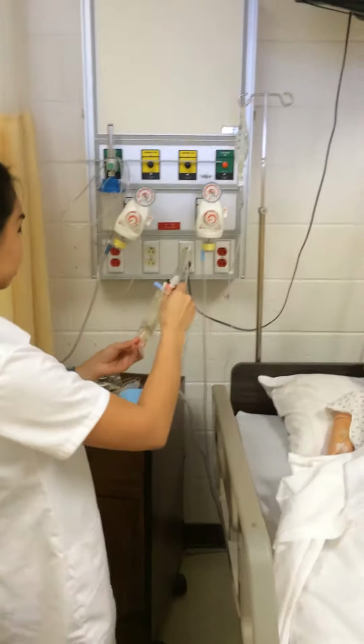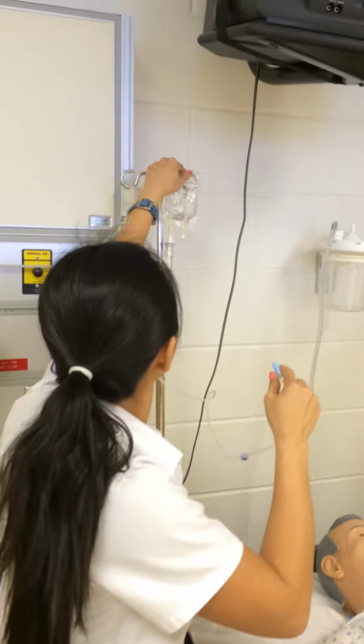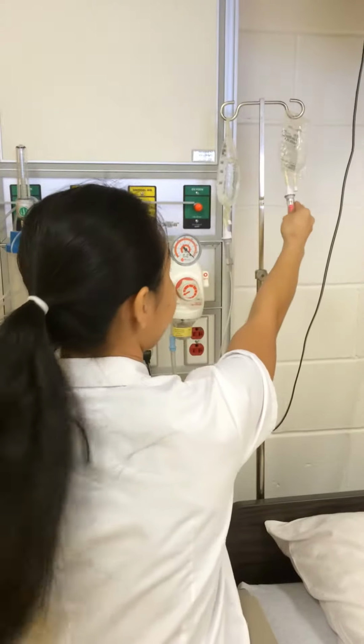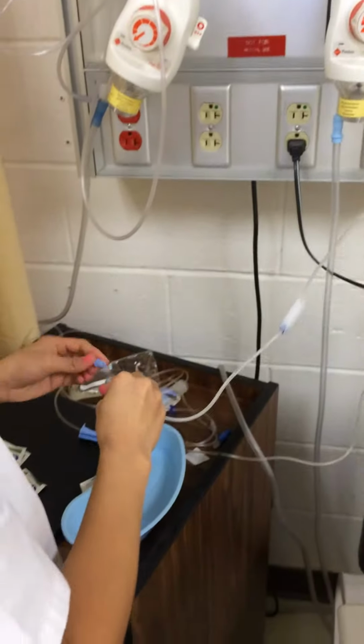I am going to hang it. I fill the chamber halfway and I prime the tube, so make sure there's no air.